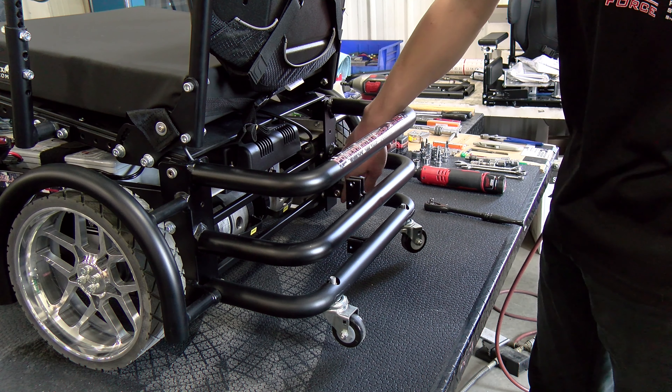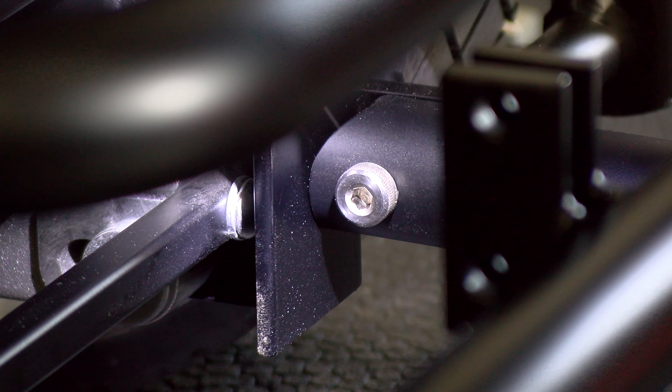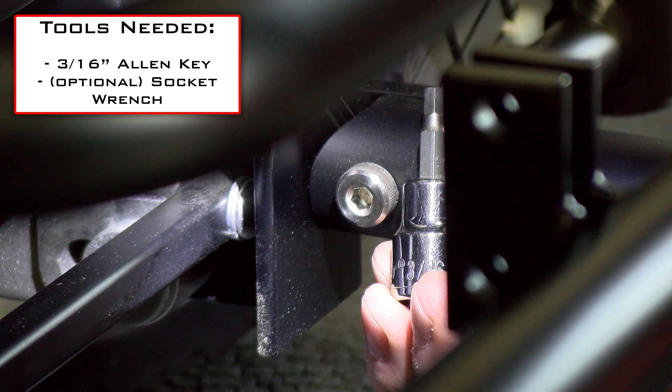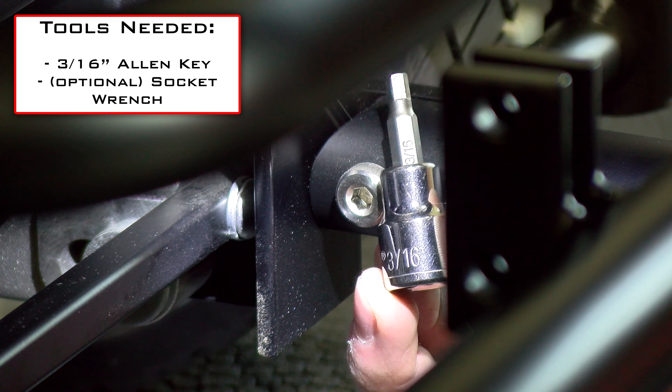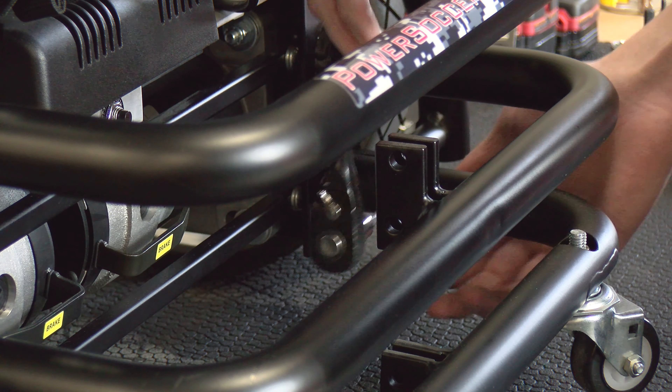Now we're going to take out the last two shoulder bolts holding the tip bar in place. I'll zoom in so you can see them a little bit better. We're going to need a 3/16 inch Allen wrench to take these out. I'm going to be using a socket again because this part can be a little time consuming and it'll help speed things up.